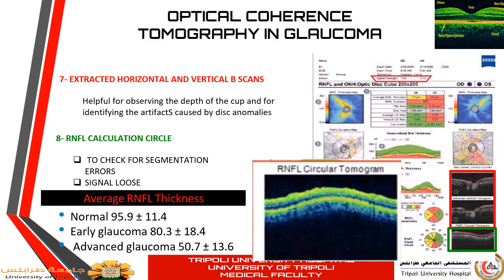That's why OCT is useful in early stages of glaucoma in the follow-up and detection of any progression. However, in advanced glaucoma, OCT is not much useful, but visual field is more useful in detection of the progression of glaucoma, and that's because of the so-called floor effect.